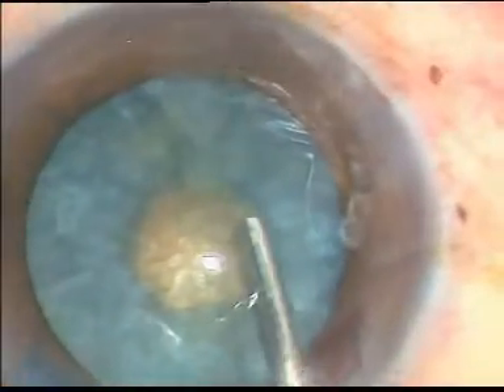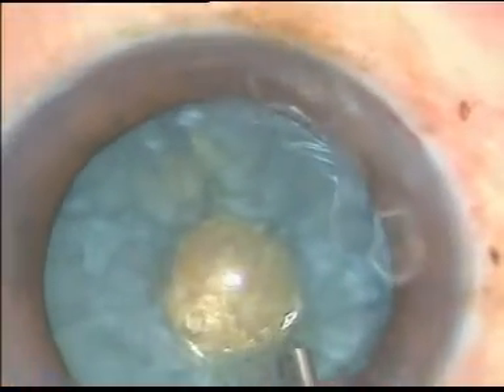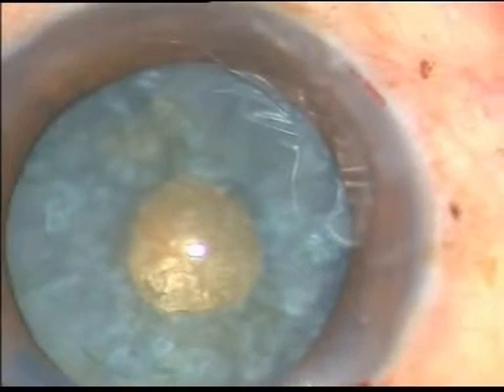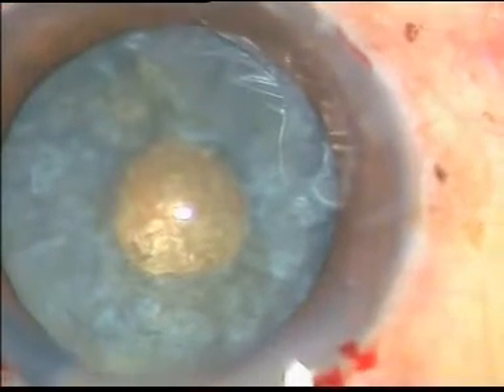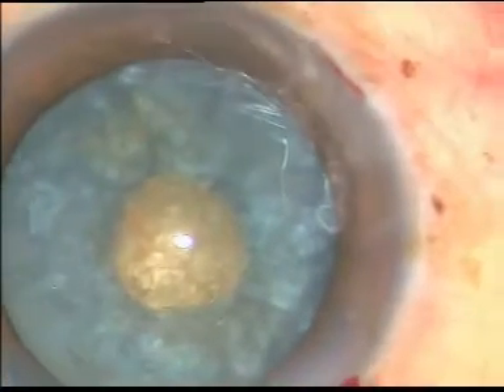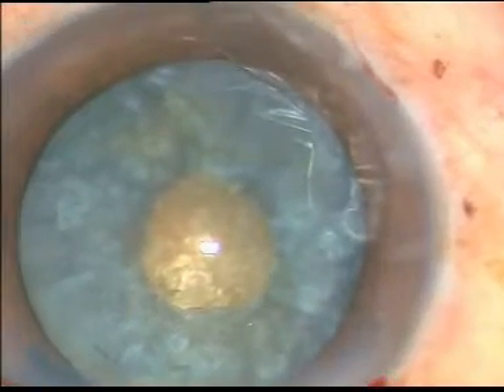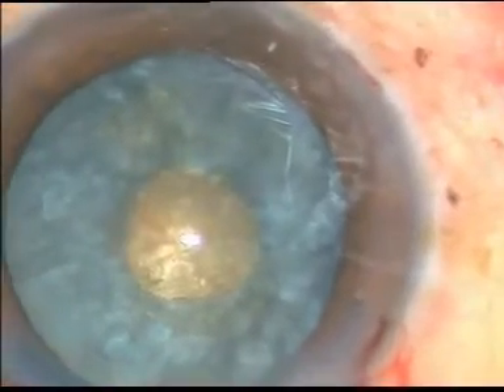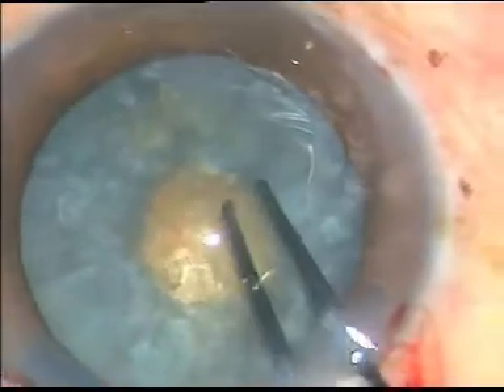Now I give viscoelastic substance — 2% hydroxypropyl methylcellulose — and the convex surface of the anterior capsule is no more there. Now I give a small cut at the margin of the small rhexis with the help of a Vannas scissor.